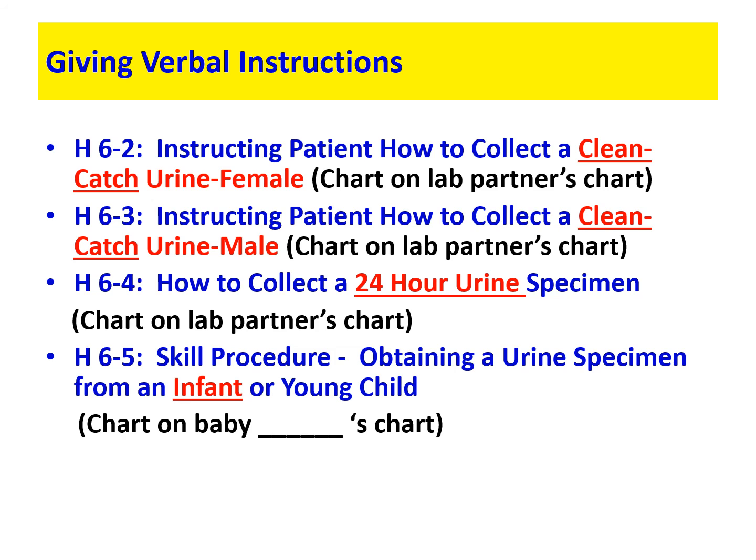So, same thing. We go through 1 through 5 and click all that off. The more you practice doing all this stuff and reading and going through it makes you do it without even thinking, right? Then make sure you instruct your patient that they need to note the time they get up in the morning. You're going to send them home with that amber color 24-hour urine jug.